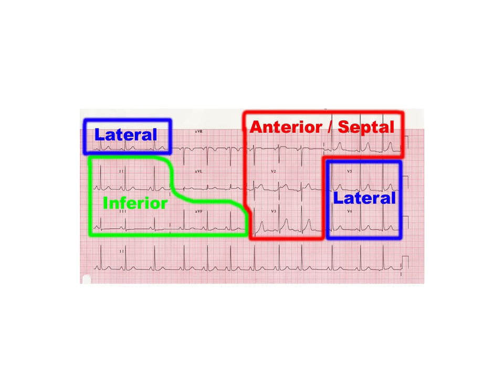You can use my mnemonics, or you can do your fancy cardiology things that you try to do when you're a gunner and you impress people in medical school. But either way, as long as you know where the leads are, I'm fine with that.